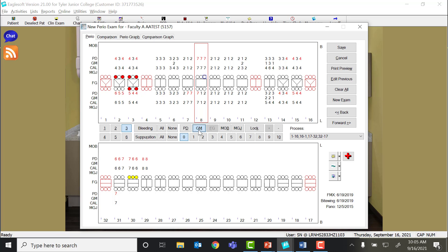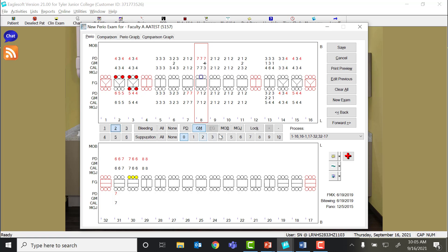When you do that, and this gets a little complicated, but enlargement is documented under gingival margin as negative recession. So just think of it as being the opposite. It's above the gingival margin. I'm going to click the negative button and say I measure down and I feel like I feel the CEJ about 4 millimeters down.